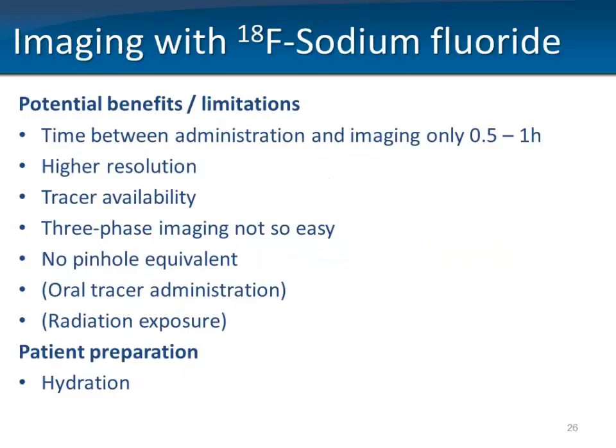So the potential benefits and limitations of sodium fluoride PET-CT tend to follow what we see in the adult population. So you can image earlier. You have a higher resolution, which is thanks to the PET technique. The tracer availability depends on where you work. Tracer availability in my country or my environment is not an issue. It is finding time on your PET-CT device to do these studies that is the issue.